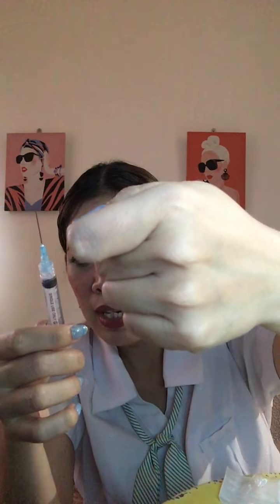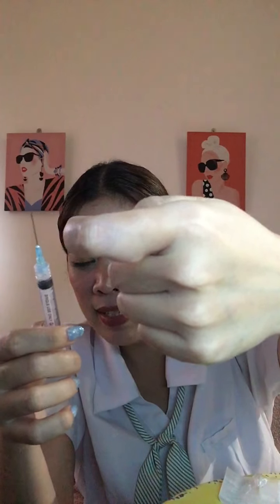Then stabilize the syringe and needle. Now inject the medication carefully, slowly, so that it produces a small wheal on the skin. The presence of the wheal or bleb indicates that the medication is in the dermis. So like a bump, a small bump has to be present on this part here.